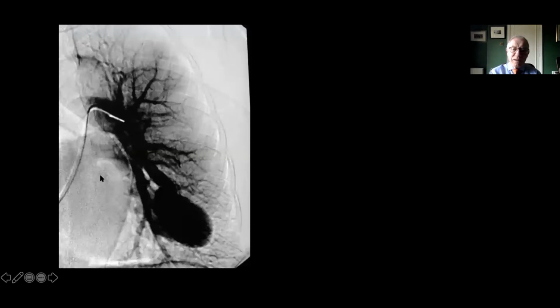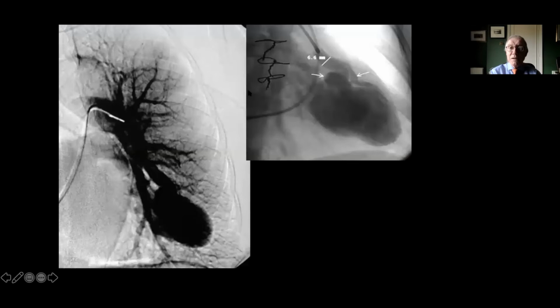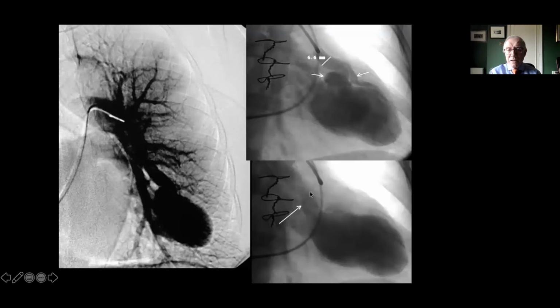This is an image from a pulmonary angiogram. That's the test we'll do with a catheter in your vein, pass through the heart and into the arteries in the lung. We inject dye, and that will show us the arteries in your lung and the PAVM and the draining vein if it is there to be seen. So getting a little bit closer to it, this is the tip of the catheter. This is the feeding artery, which branches in two with a big sac or a big nidus. And then a moment later, we see some filling of the vein draining away from it.